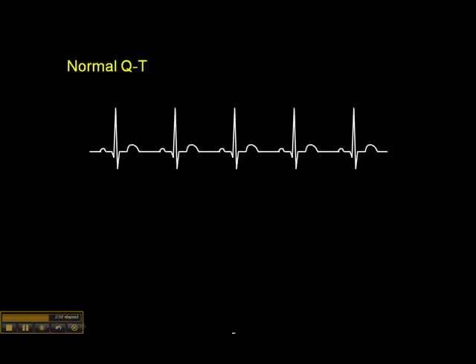If it appears to be prolonged, I'll look at it in a little more detail. A normal QT interval should be less than half of the R-to-R interval. So here's the R-to-R interval, and the halfway point is about here. You can see that the T wave ends before the halfway mark. So that's a normal QT interval.